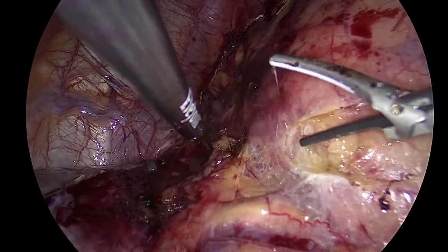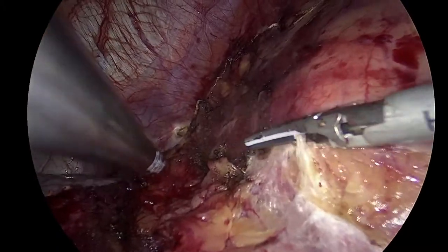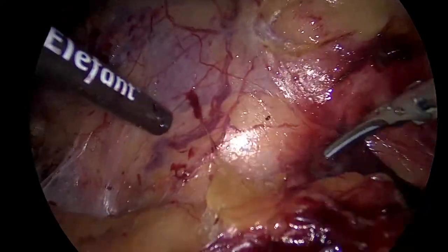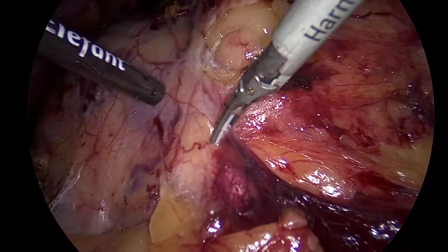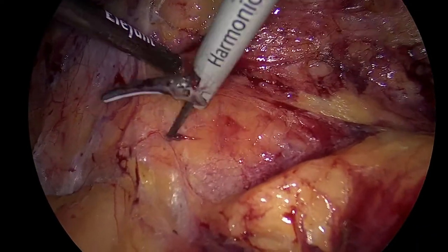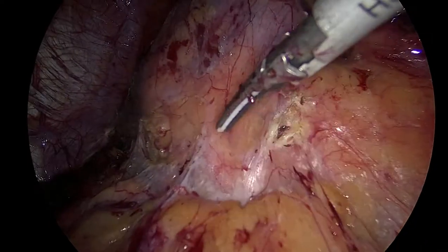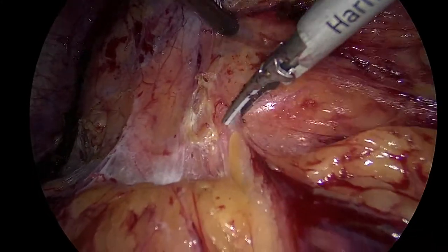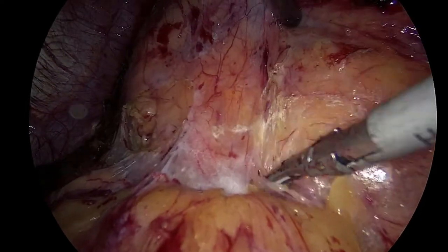It doesn't happen. Come in. In this case, you don't see the superior mesenteric artery, but in some other cases, you can really see it. Okay, go back. Okay, come here. Good. Again, here. We do not go down here with the dissection. You go up here to retract your fat. There you go. So if you cut here, you can go in strange locations. You cut superficially there, and you peel down, like this. Excellent. Like this. And peel down.